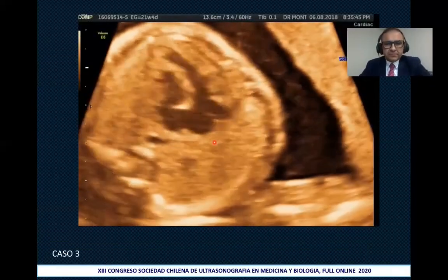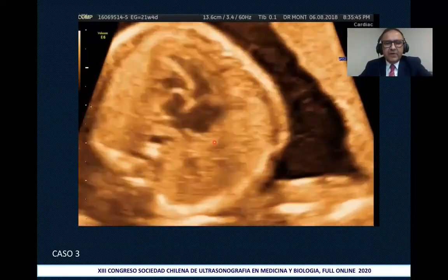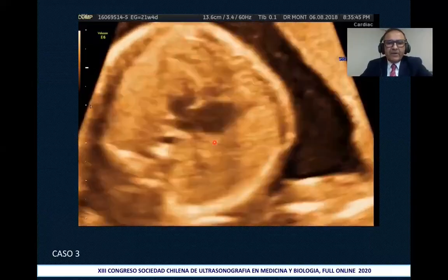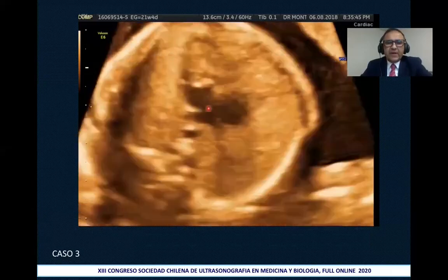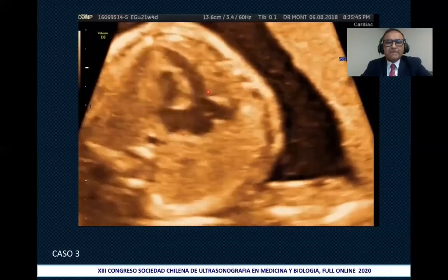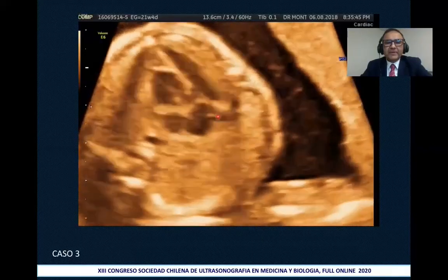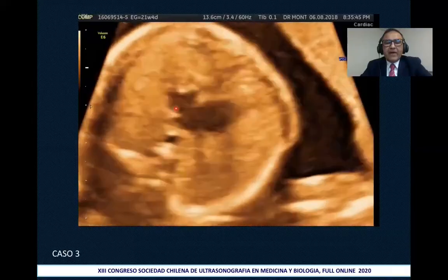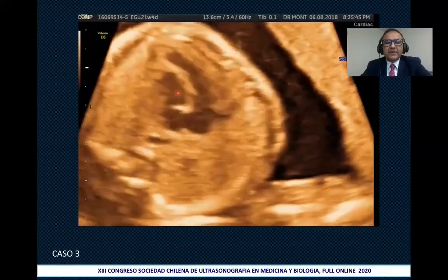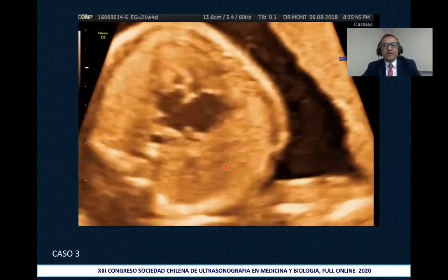Another case, the fetus is in a cephalic presentation with the back laterally to the right, and we see a slightly marked levocardia there. Please observe the four-chamber view here. The right atrium communicates through the mitral valve with a smooth morphology ventricle, which is the left ventricle. As you can observe here, the left atrium connects through a tricuspid valve to a posterior ventricle with right-sided morphology. Therefore, we would also be dealing with an atrioventricular discordance.